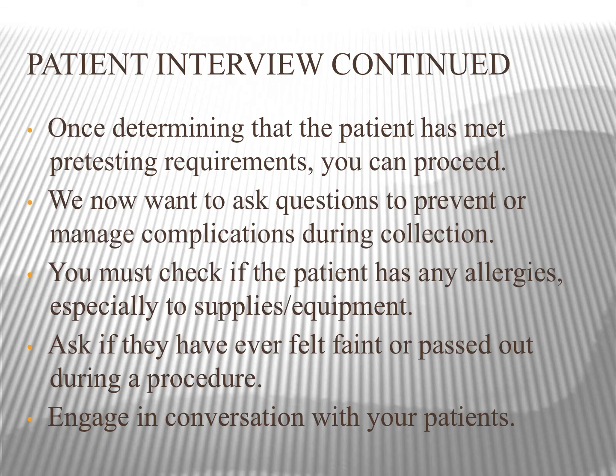Once we determine that the patient has met those pre-testing requirements, then we can proceed with the blood draw. We want to ask questions again to prevent or manage complications during the collection. Do they have complications when they have their blood drawn?